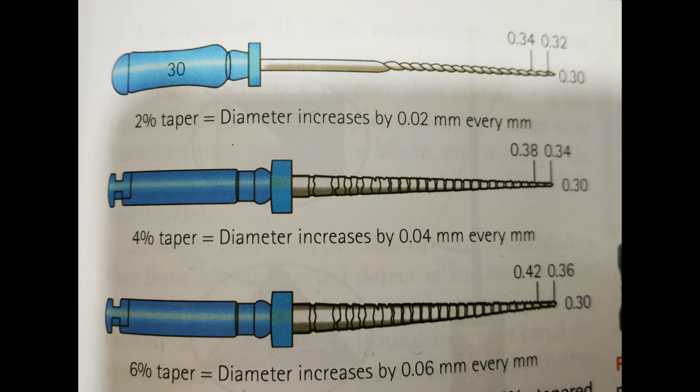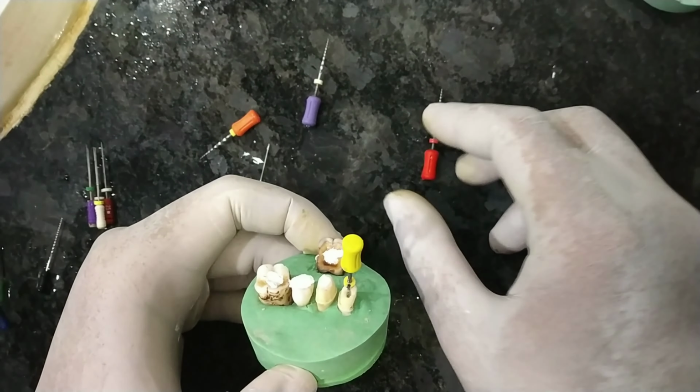Tapered instruments help in preparing canals of wider diameter without over enlarging the canal at the working length. Thus a 30 size file with 2% taper, 30 size file with 4% taper and 30 size file with 6% taper all would have the same tip diameter of 0.3 mm.